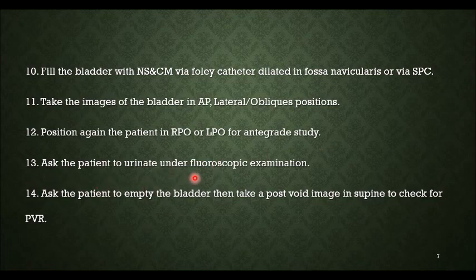Ask the patient to urinate under fluoroscopic examination. At this time, focus on the urethra, and also on the areas of the ureters to check that there is no vesicoureteric reflux when the patient is pushing. Ask the patient to empty the bladder, then take a post-void image in supine to check that there is no significant PVR.